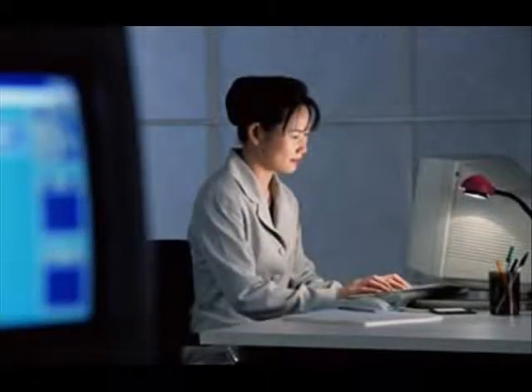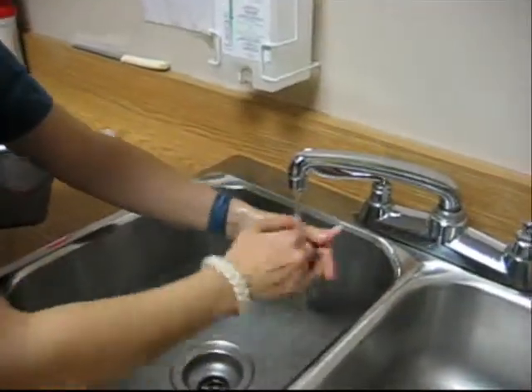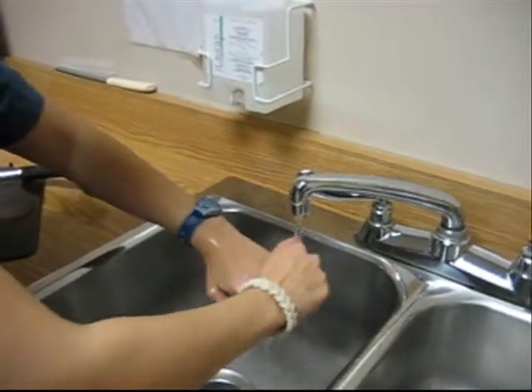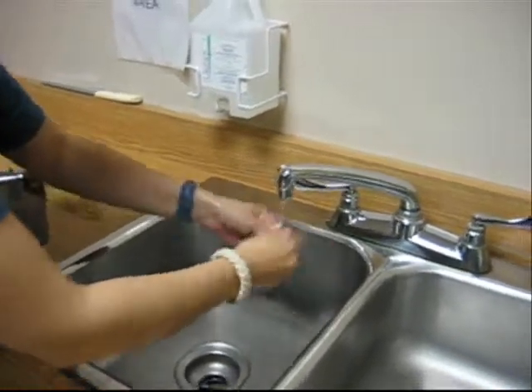A review of the chart or the medical record, according to the site policy and procedure at which you're rotating, is required prior to starting mechanical ventilation. Follow infection control procedures, including the thorough washing of hands and the donning of gloves prior to the initiation of mechanical ventilation.